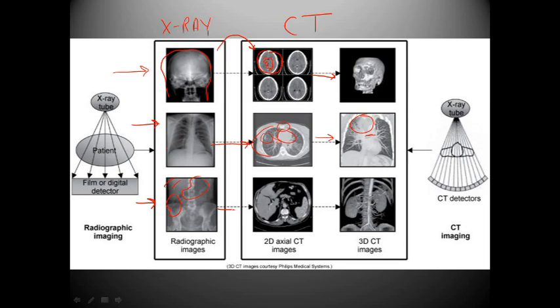If we change over to computer tomography, we can now see the aorta, the liver in its entirety, the spleen, all of the intestines and ribs as well, and even the musculature. And then if we manipulate it into a 3D reformatted image, we can see the aorta, see if there's abnormalities here. We can see the kidneys. And so just a higher degree of differentiation in terms of CT versus all the other modalities. And so that's why conventional radiography in many cases has lost a lot of ground to CT.